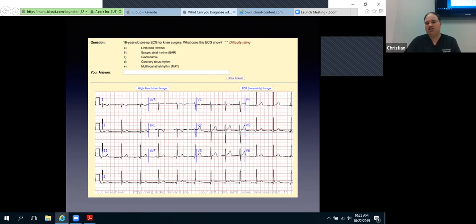I know that EKG is going to go to other providers sometimes, so I purposely only mention, if it's sinus rhythm, what the axis is and what the ST segments are. So I'm not boxing anybody else in on their interpretation of the EKG. I'm giving a very basic, minimal interpretation that's safe enough to disposition that EKG and that person without boxing my colleague into a different interpretation later.